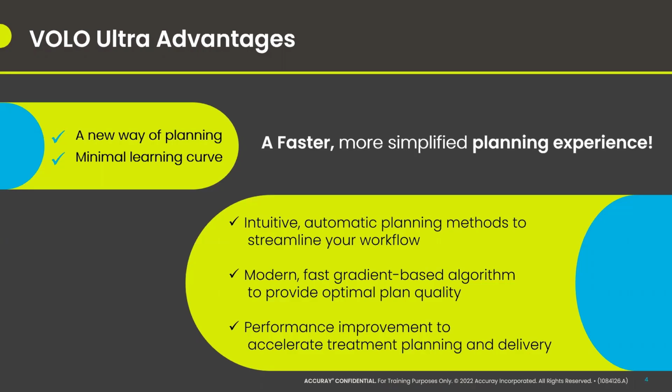And depending on how you may have planned previously, there's a really good chance that it's going to improve your treatment beam-on times. And this is going to be without sacrificing quality. So these improvements are extremely important, not only for you, our customers, I think, but for our patients. And one thing to note is that during our initial studies, we found that there was up to 90% reduced planning time. That's pretty significant. And that was followed by a reduction in treatment beam-on times. And I believe that even our most proficient, experienced planners will most likely produce the lower beam-on times with the VOLO Ultra. And they're going to definitely see planning times reduced.